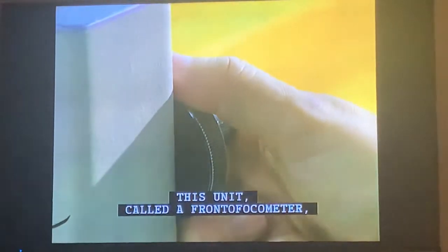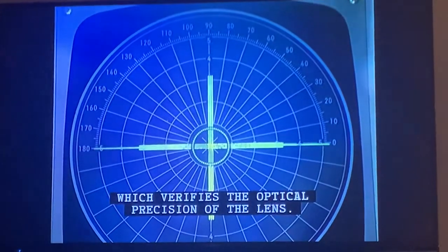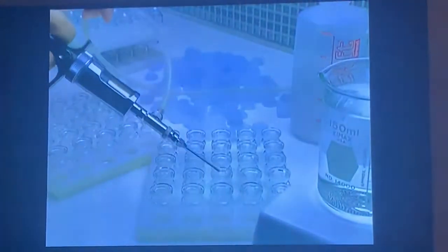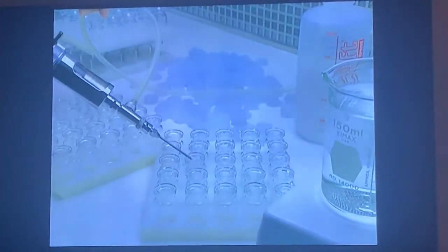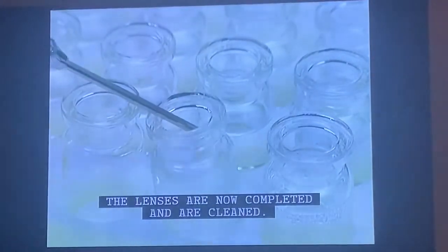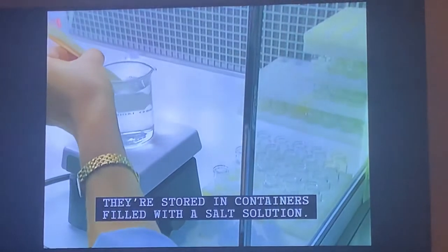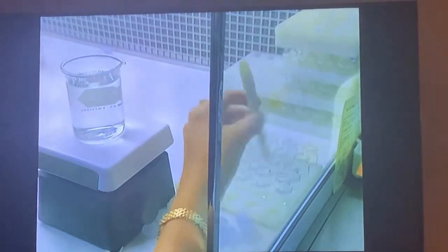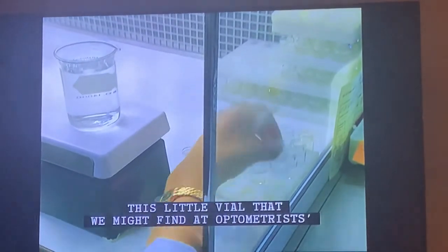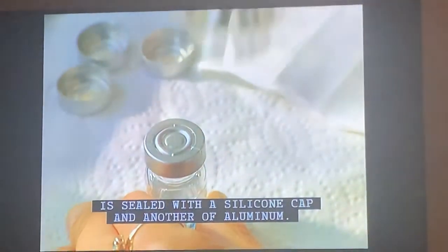This unit, called a frontofocometer, is a metering device which verifies the optical precision of the lens. The lenses are now completed and are cleaned. They are stored in containers filled with a salt solution — small vials sealed with a silicone cap and another of aluminum, like those found at an optometrist's office.